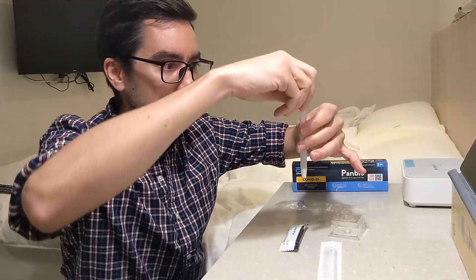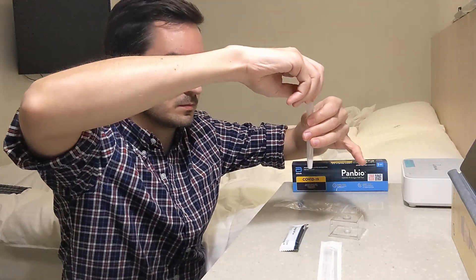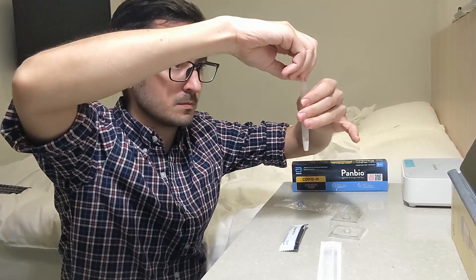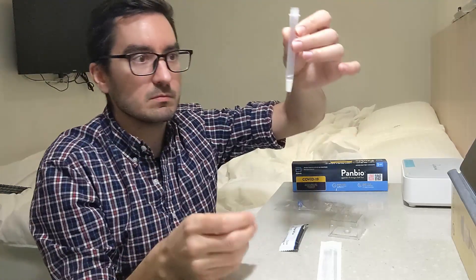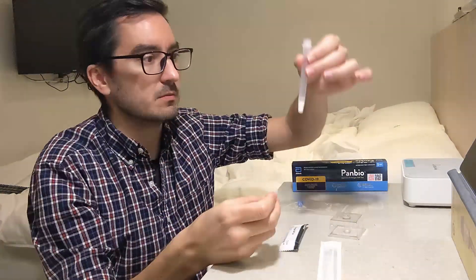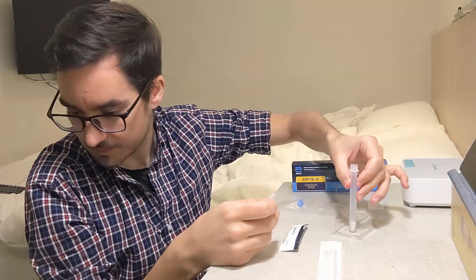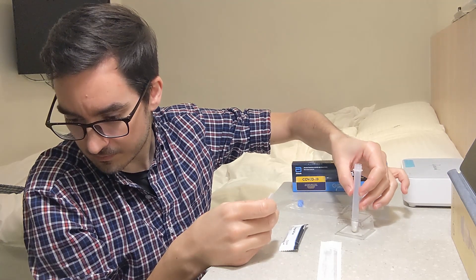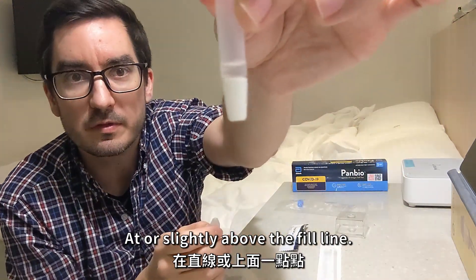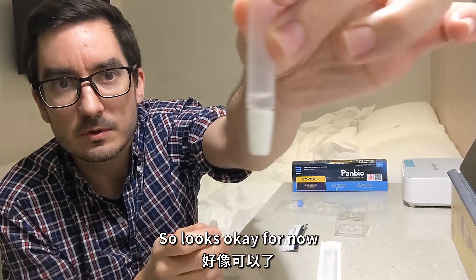Put it in here. Goes up to a little line — at or slightly above the fill line. So that looks okay for now.